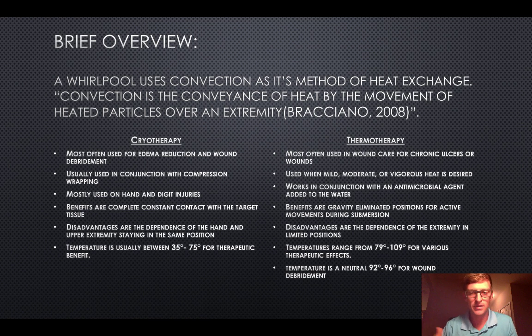So for thermotherapy, superficial heat, it's most often used for wound care and chronic ulcers or wounds, similar to cryotherapy. So inflammation, pain. It's used when mild, moderate, or vigorous heat is desired. It works in conjunction with an antimicrobial agent added to the water, and that's to help debride and clean the wound.